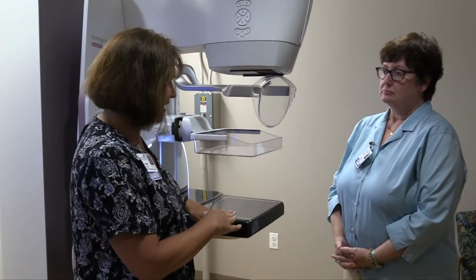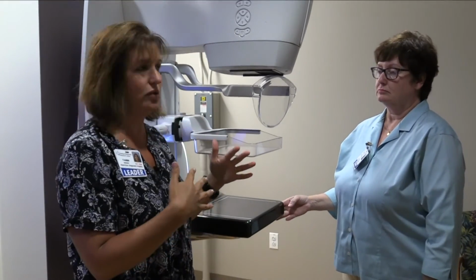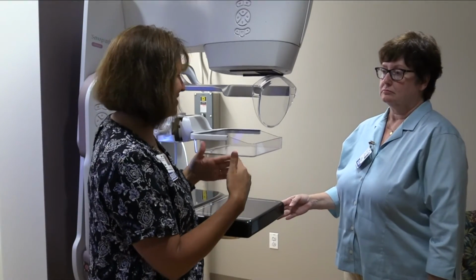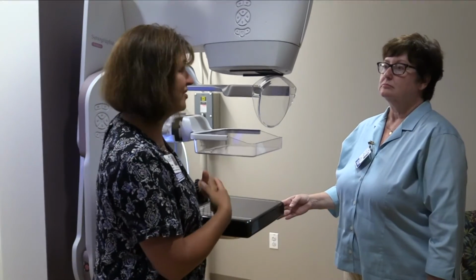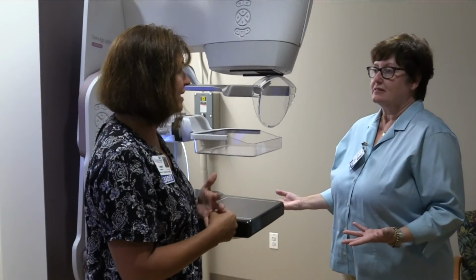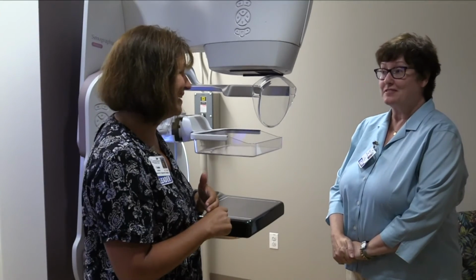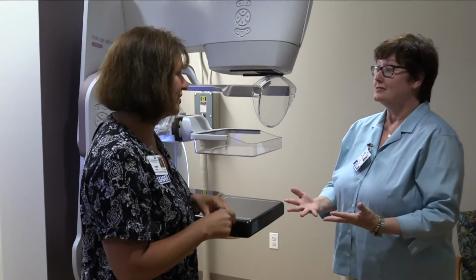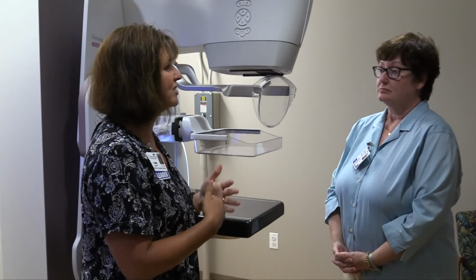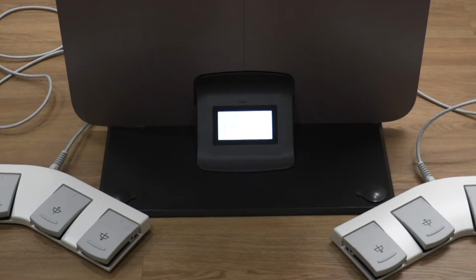When they actually have the exam, this machine moves over their head, does not move or affect the patient. It is a little more streamlined because as soon as they're done, they get changed and they're done. Okay. There's no delay. And how long does the process take? A mammogram is scheduled for 15 minutes. That's a short amount of time for something that's so critical. Correct. It does not take a long time. The new technology makes it so we get so many images and so much information that it's a quick and easy process.